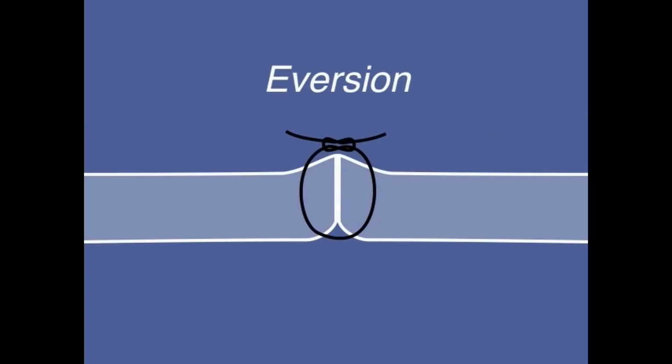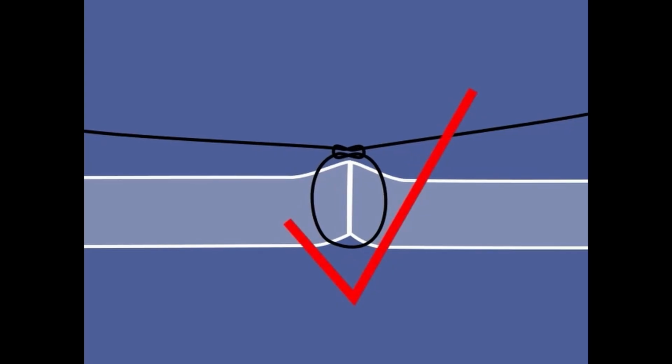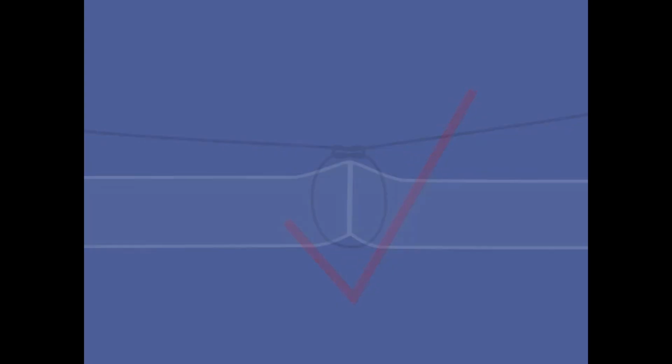For eversion, increase both components. Lift the wound edge more, and rotate the needle more so the pass becomes steeper than 90 degrees. Repeat that same steeper roll on the way out. When the knot is tightened, those steeper bites intentionally tip the edges up. Eversion helps the wound edges heal and reduces scarring. When the suture is removed, the edges will lie flat and lead to better cosmesis.